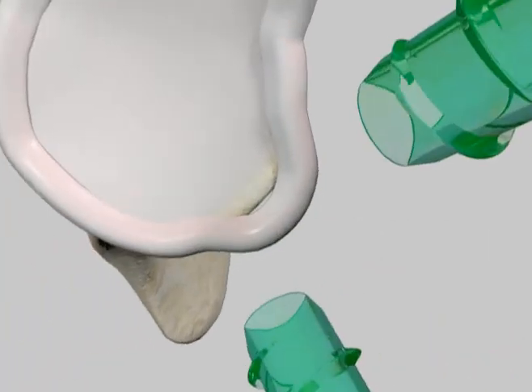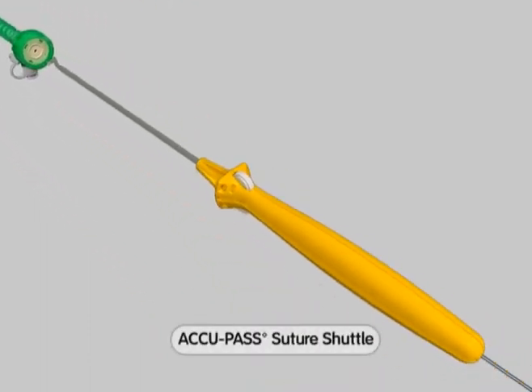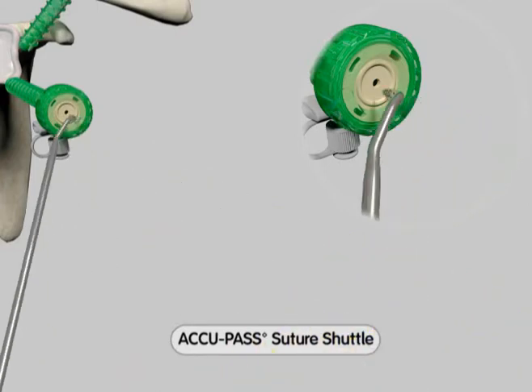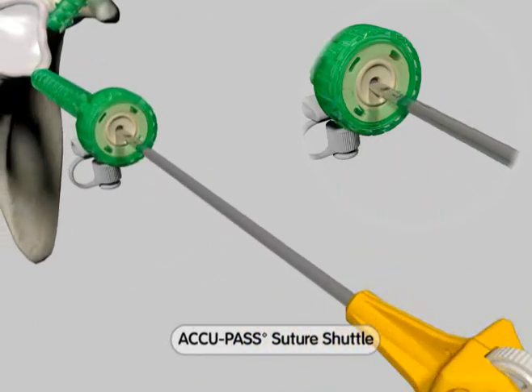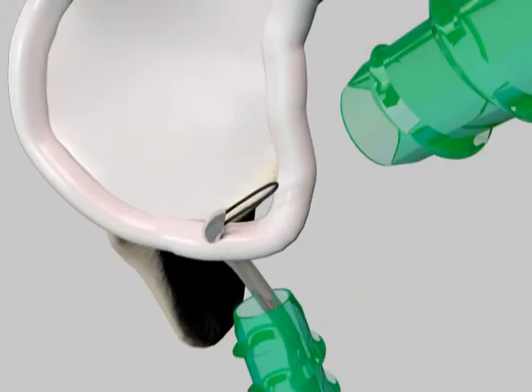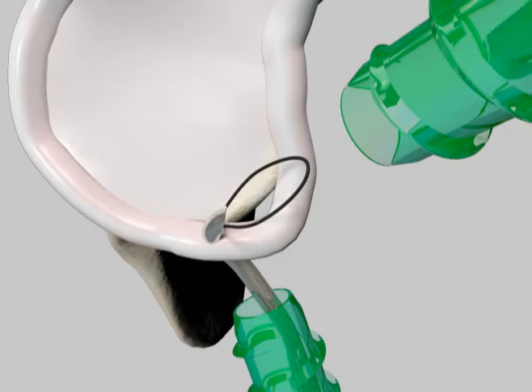The first step is passing the ultrabraid suture with our AccuPass suture shuttle. The device is placed through the inferior working cannula. The tip is placed through the labral tissue inferior to the tear to be repaired to allow for maximum tissue shift. The monofilament loop is advanced into the joint space.